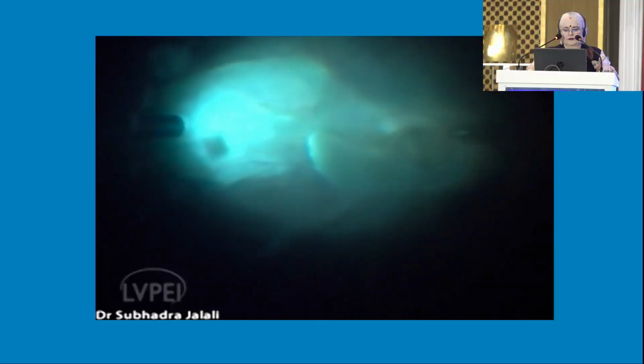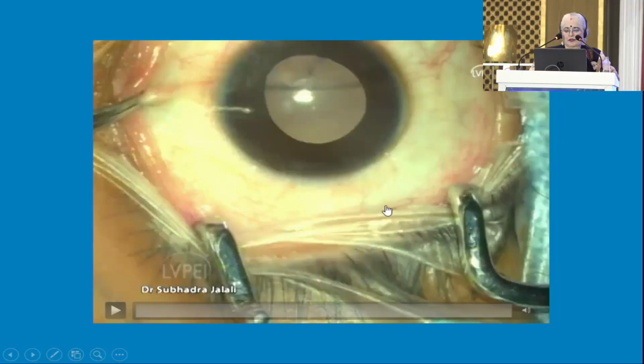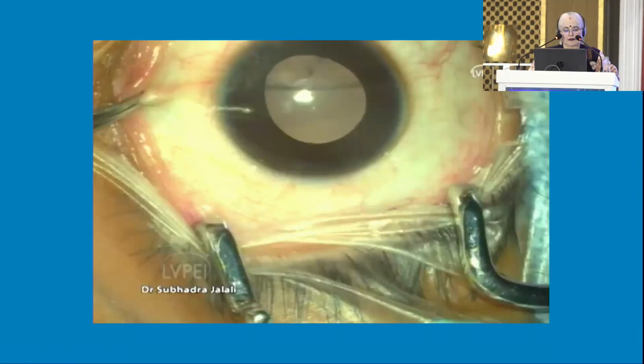But otherwise, as you saw, it does come out pretty easily, and it's not very difficult to remove. So we have to be patient and remove it slowly, because sometimes the adhesion is very tricky at the fovea and you can create a foveal break.